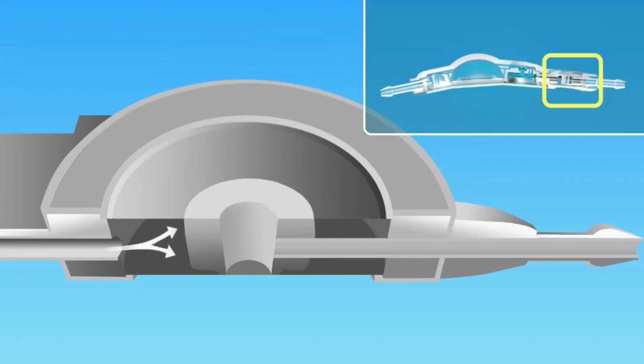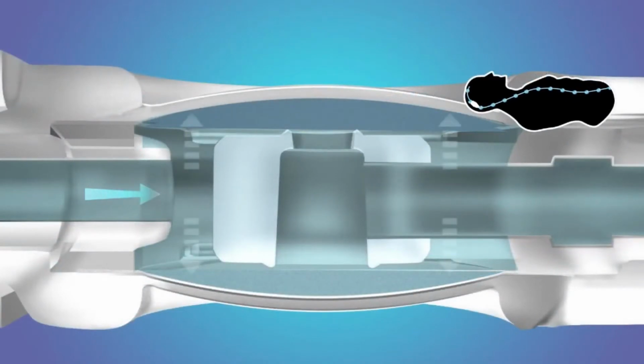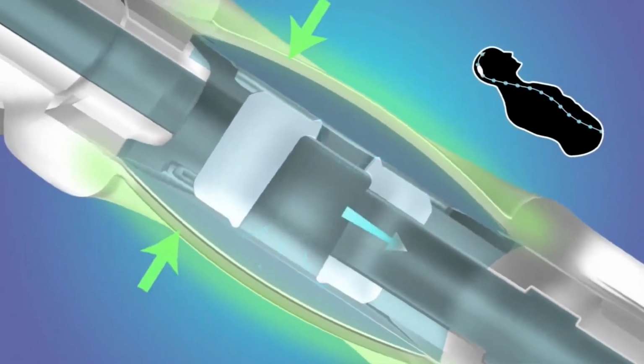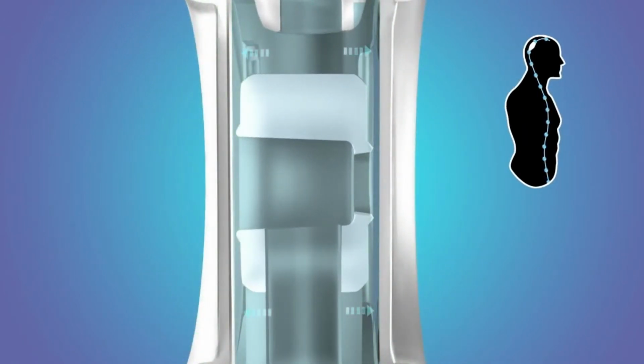The inlet area of the Delta chamber diaphragm is greater in size than the outlet drainage port, thus allowing positive inlet pressure to control the Delta chamber, while minimizing the effects of the negative hydrostatic outlet pressure. When the patient is in the supine position, the membranes on either side of the delta chamber are relaxed or open, allowing for CSF flow. When the patient stands up, the negative pressure pulls the membranes closed, reducing the flow of CSF.